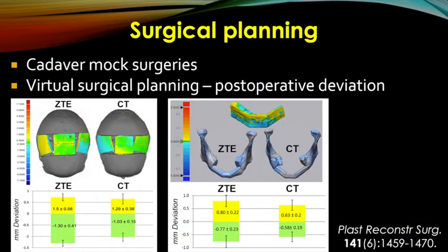Because ZTE is not yet standard of care, we cannot perform actual patient surgeries based on the technique. However, our surgical collaborators have performed mock craniotomies and fibular free flaps on cadavers, and were able to show that virtual surgical plans based off each modality did not differ significantly in the postoperative deviation from the plan, and both were well within surgical precision limits of 2 millimeters.